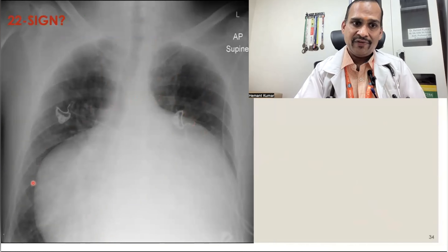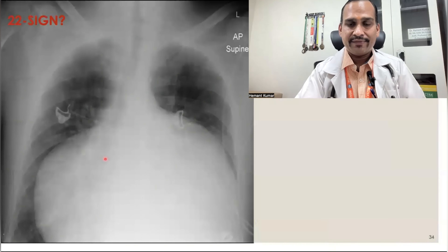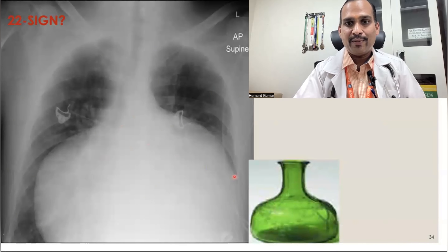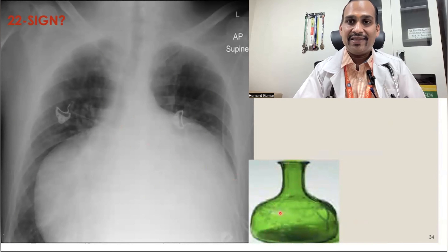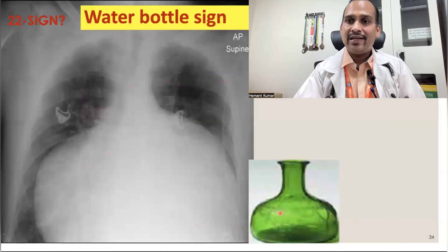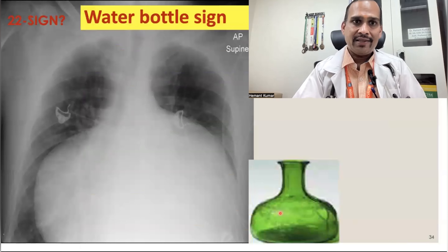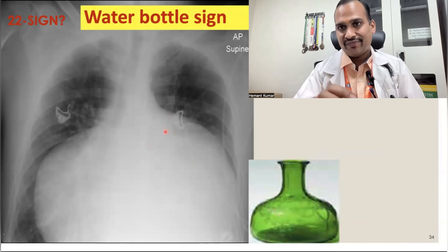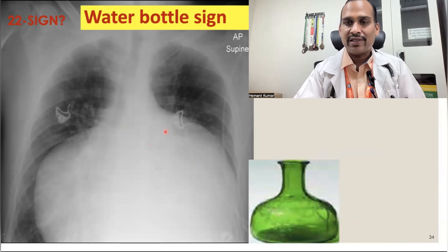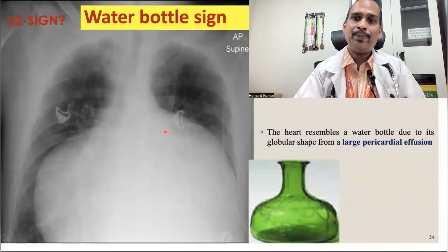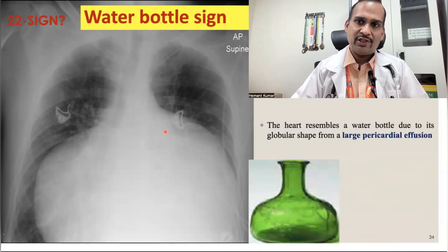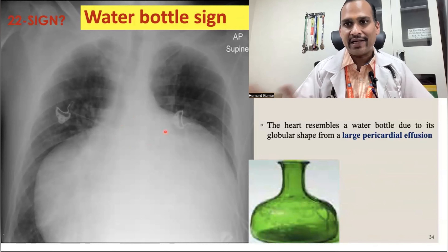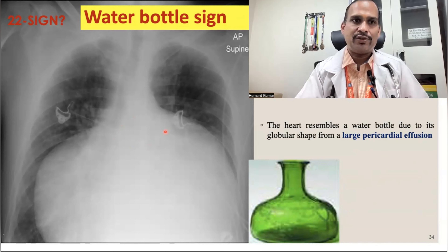Sign 22 is the water bottle sign, seen in adults. There is enlargement of the heart that looks like a bottle. This is seen in pericardial effusion — usually large pericardial effusion, not small.